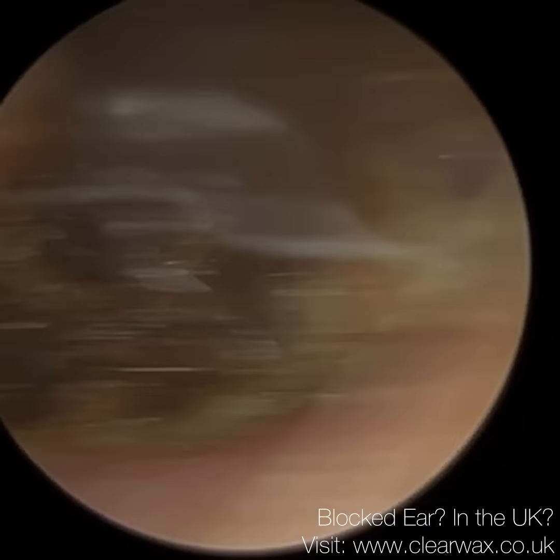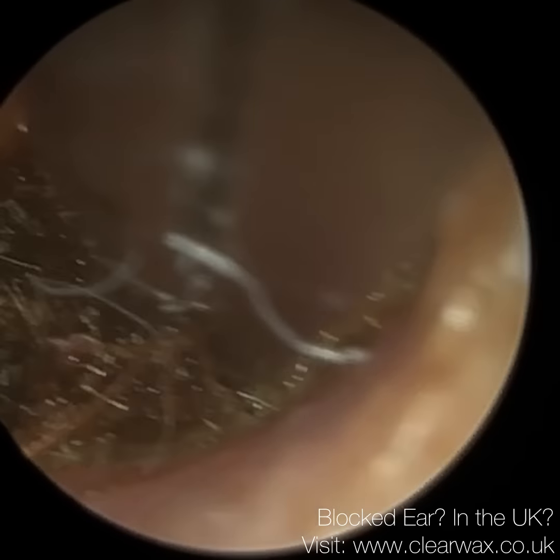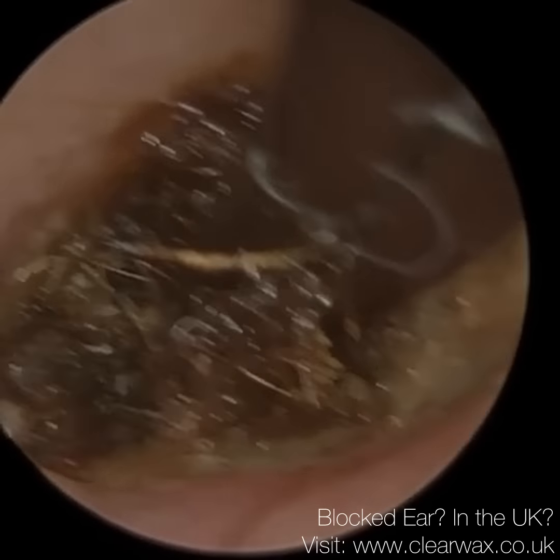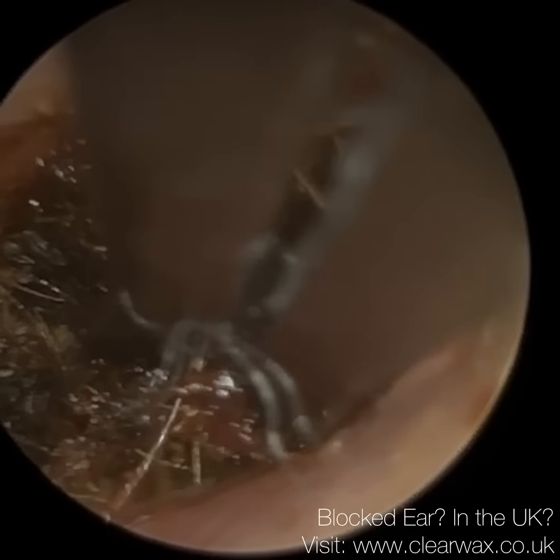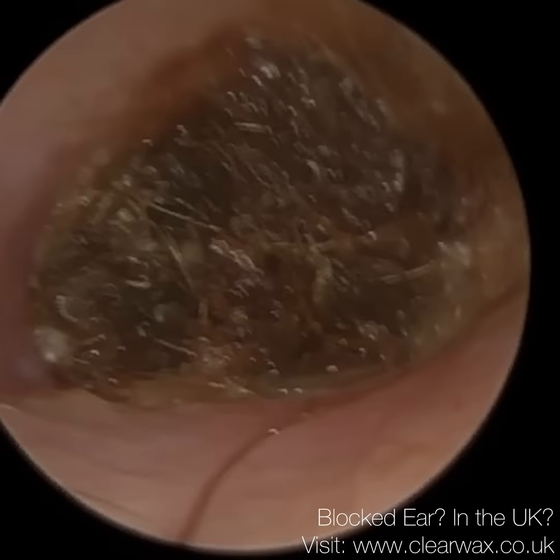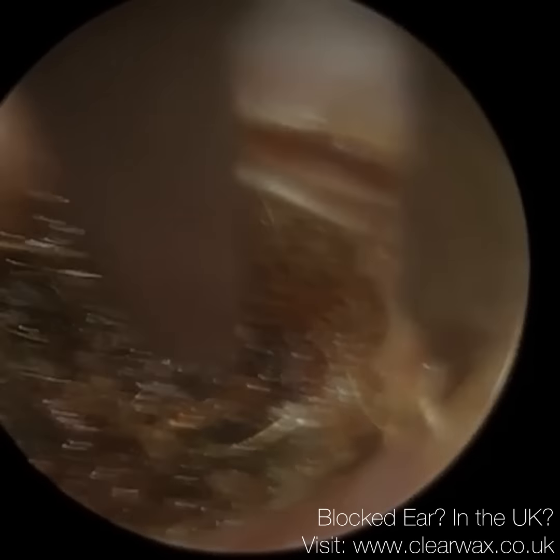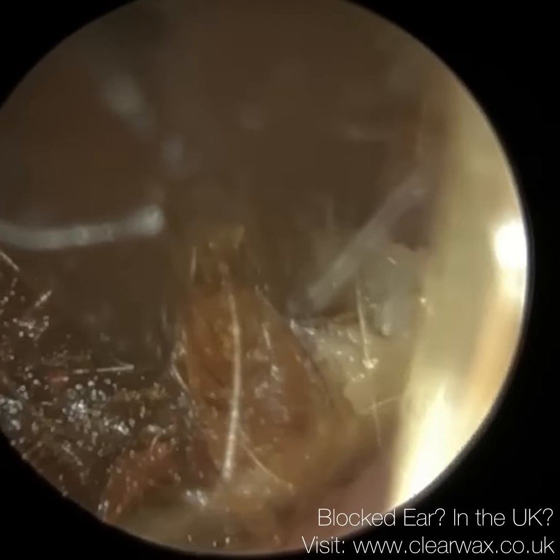So this is my first upload using the endoscope of 2025, and it's of a patient who I saw a week or so ago, and they attended with this severe impaction in their left ear. I did initially start with the wax scope, but I decided to revert to the endoscope, primarily because this patient, I suspect, has possibly a grade 2 keratosis obturans.